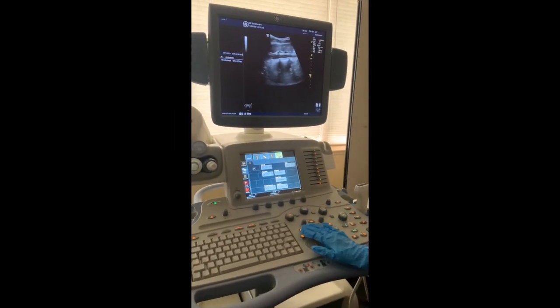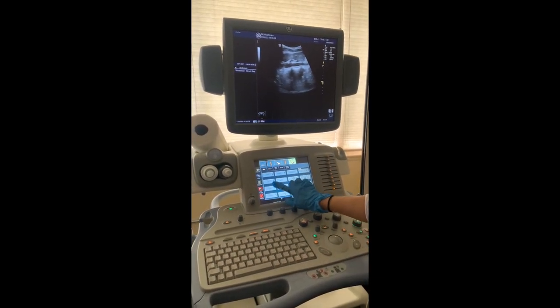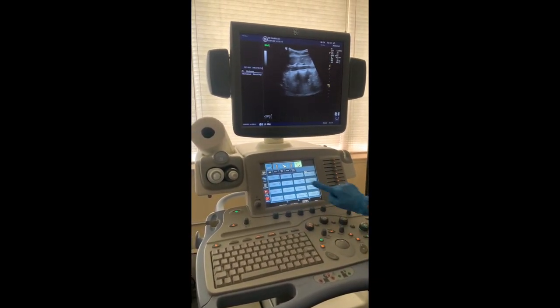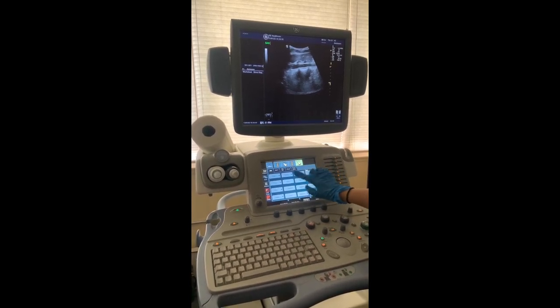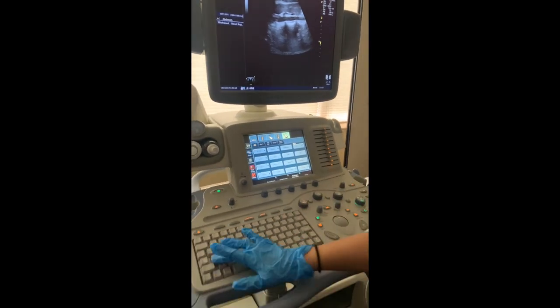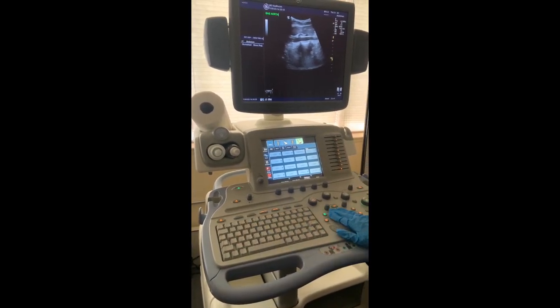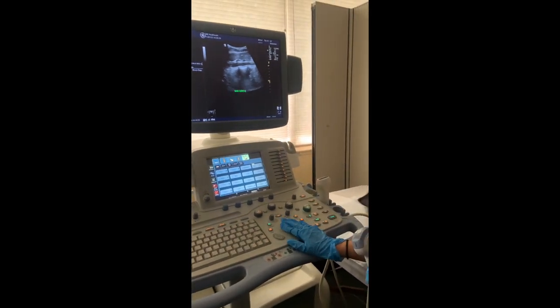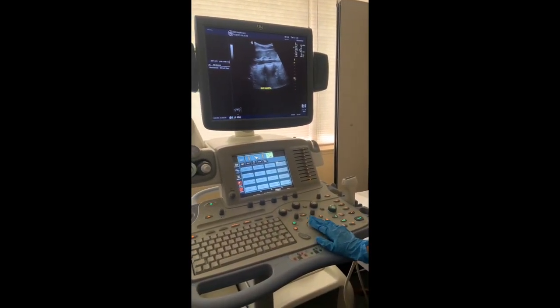To annotate your images, select the comment button and type using the keyboard. Some ultrasound machines come with preset annotations that sonographers can use as well. For your annotations, be sure to include your transducer orientation, such as transverse or sagittal, and the area of interest, such as right kidney, liver, or spleen. The annotation example here is the sagittal aorta.